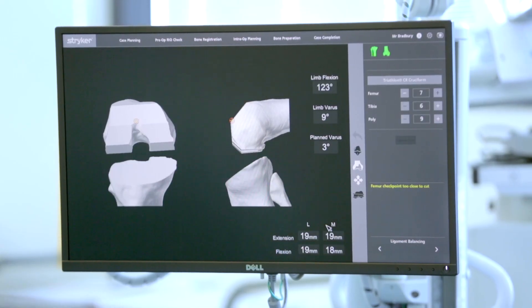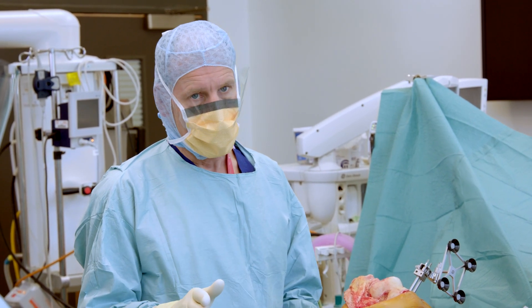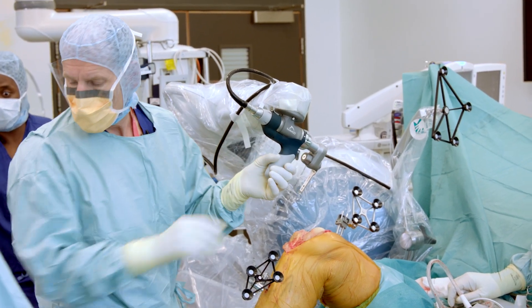Essentially, we now have a knee that is very beautifully balanced. If we make the cuts we've now planned, this knee should fit perfectly and I should need to do no ligamentous releases. The final stage is execution, where the robot assists me in making very precise and extremely accurate cuts, and thus restores the patient's knee shape, alignment, and ligament tension — as if the patient had a normal knee. We can now bring the robot in, which will help me execute that plan with a high degree of accuracy.